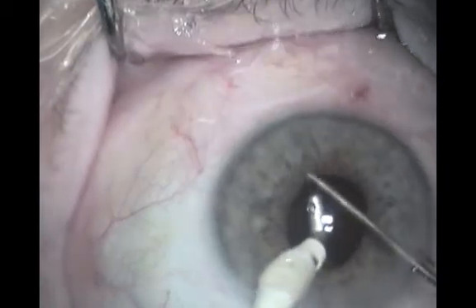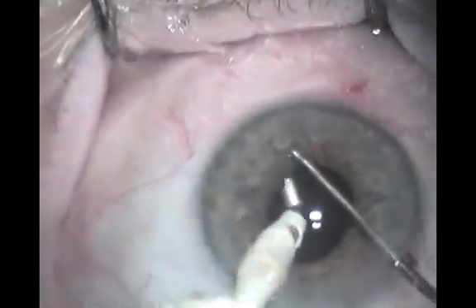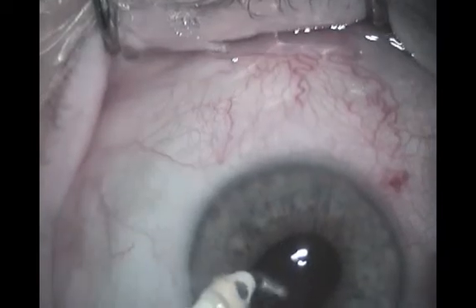Only when it is felt that the tip has reached cortex should aspiration be commenced at low vacuum. If the cortex is engaged, it should be gently drawn towards the center of the bag to allow its visualization. In some cases, with very small pupils, iris hooks may be needed.